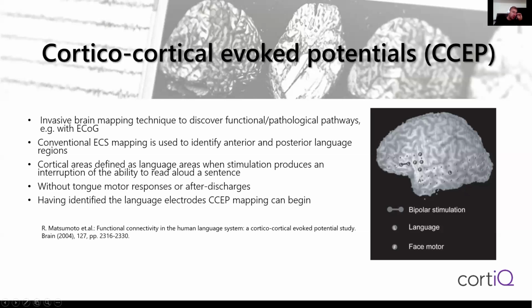And when you stimulate with a single pulse, for example, into the language area that you identified probably beforehand with electrical stimulation session or with high gamma mapping or with fMRI, then you can stimulate into that already annotated area and then identify related areas, for example, face motor or receptive language areas that are connected to this region. So this is a measure of connectivity when we see a very strong evoked potential on distant areas.